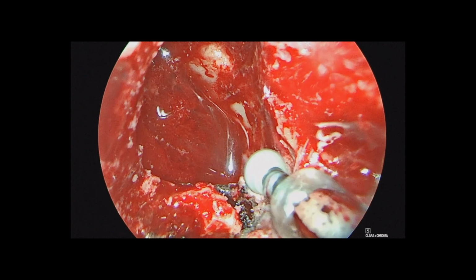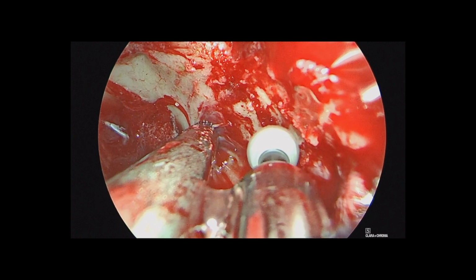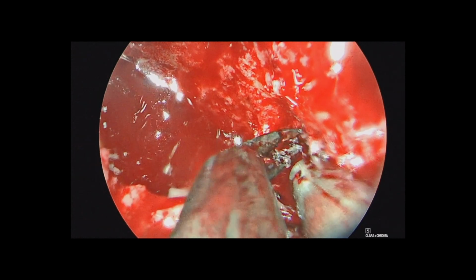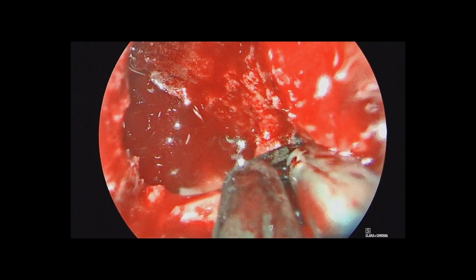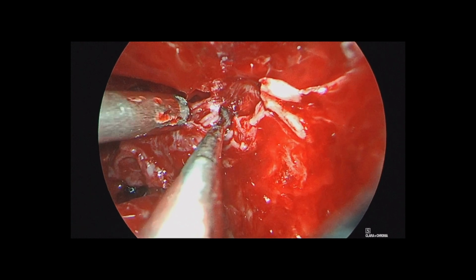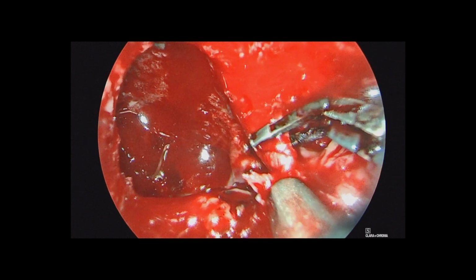This exposure allows us to retract the contents of the pterygopalatine fossa inferiorly and laterally and better expose the foramen rotundum as it works back towards Meckel's cave. Once we've exposed V2 in this area, as you can see, we're dissecting out the nerve here through foramen rotundum and the entirety of the soft tissue and periosteum around it.